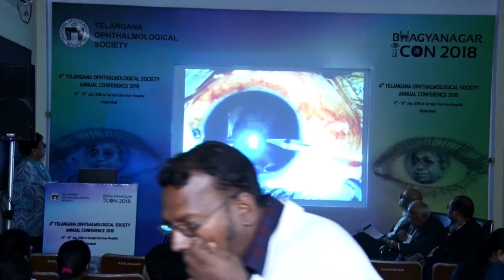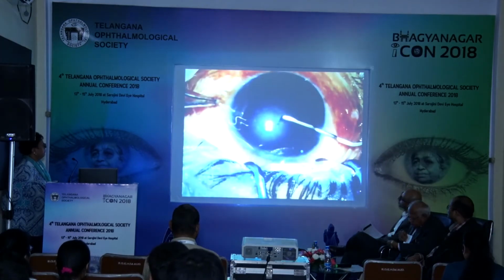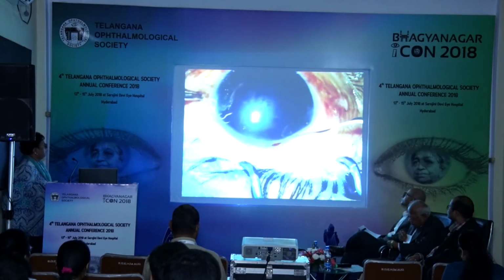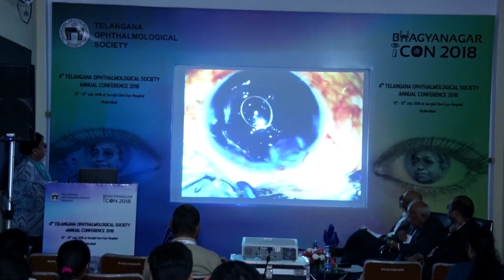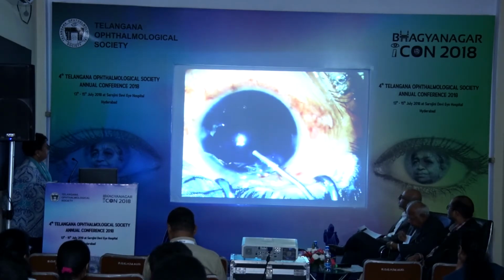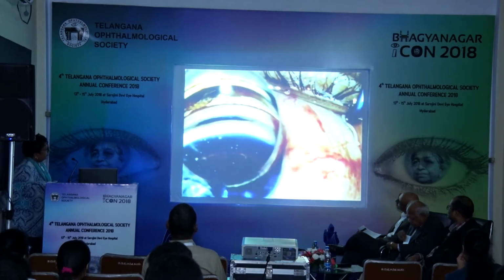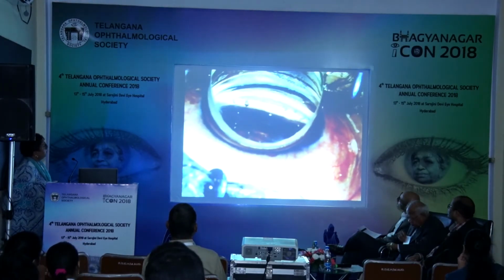Under sterile conditions and topical anesthesia, he underwent a routine lens aspiration surgery through a clear corneal incision with a foldable implant in the back. Following this, the anterior chamber was inflated with viscoelastic, which not only deepens the chamber but also facilitates visualization of the angle structure.